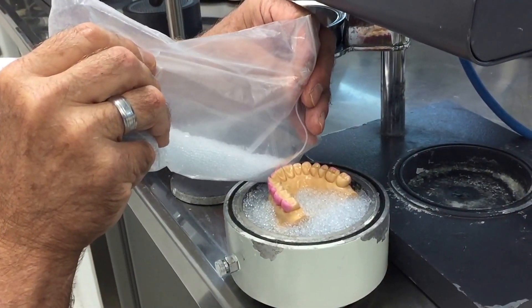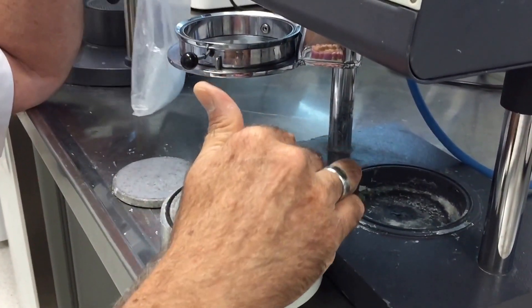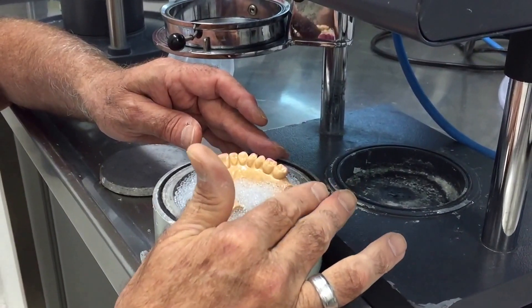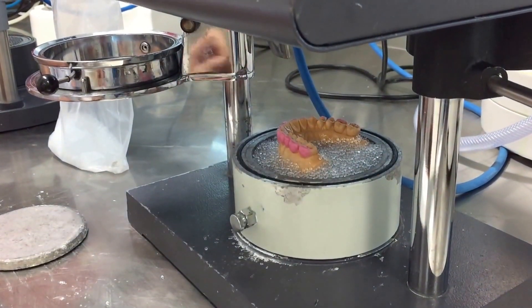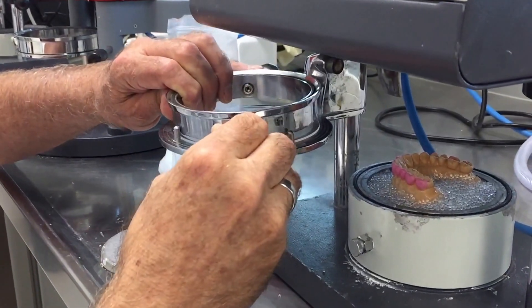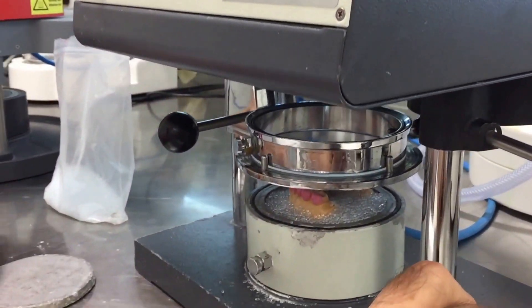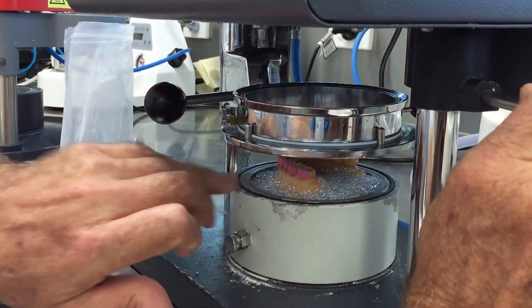That means the blank doesn't have to be stretched as far, so you end up with a nice thick blank while preserving the height of your model. Otherwise, if you don't have the ability to do this, you might have to reduce the height of your model on the grinding machine so you don't pull the blank too thin. I would prefer to use a half-mil blank and use this bead to limit the distance the blank has to be stretched. We take our blank, sit it on the table, put the ring in place, and I've set the heater to one minute and five seconds.